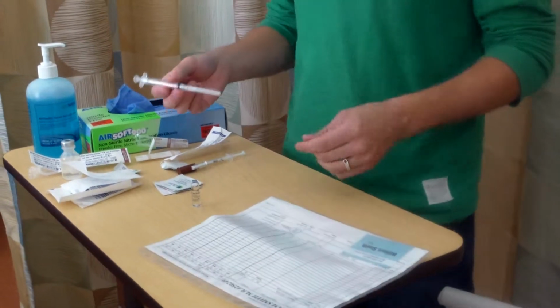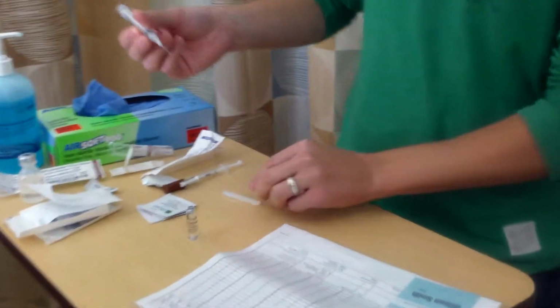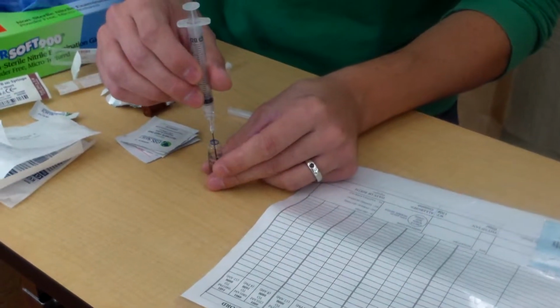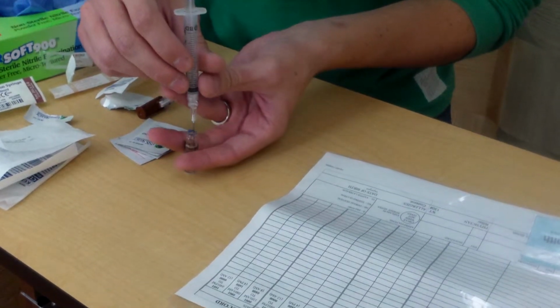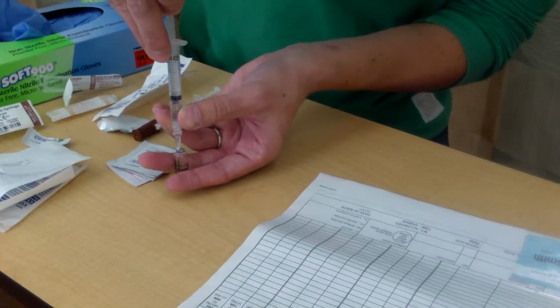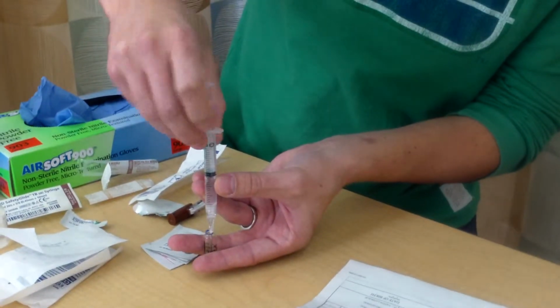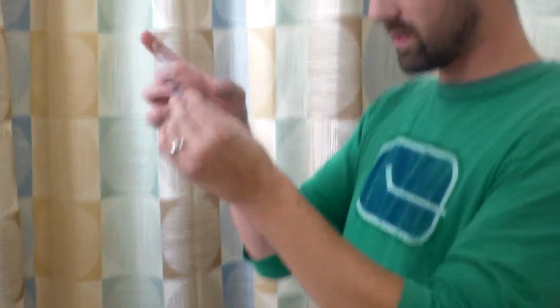I would then be very cautious not to touch the outer edge of this when withdrawing with my filter needle. So I'm going to carefully insert. Okay, I am just going to hold it there and stabilize it. And then I'm going to withdraw, but you do not aspirate this. So I'm going to withdraw practically all of that, and then make sure there's no air bubbles. There's a big one in there. There we go.